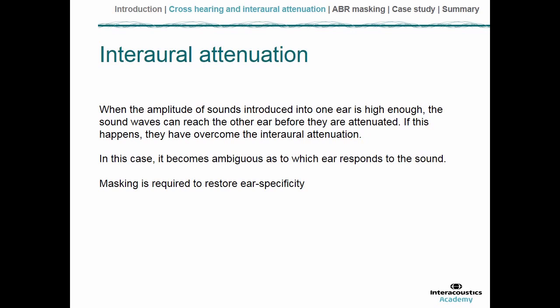And so when we present the sounds of a high enough amplitude, then the sound waves may exceed the interaural attenuation and reach the other ear. Now this is really important from the point of view of pure tone audiometry, because pure tone audiometry relies upon being an ear-specific test, both to accurately diagnose the extent and the configuration of a loss, whether it's air bone gap or completely sensory neural or completely conductive, and also of course which ear is worse and to what extent.